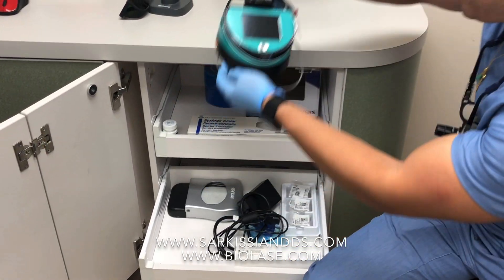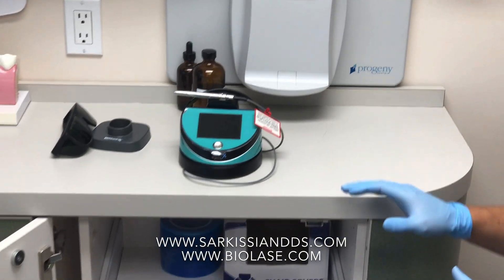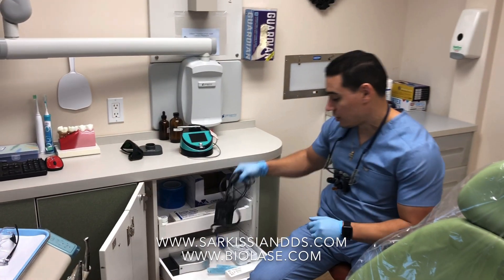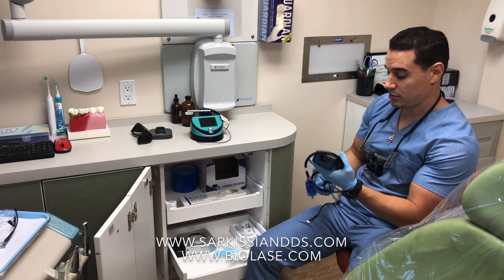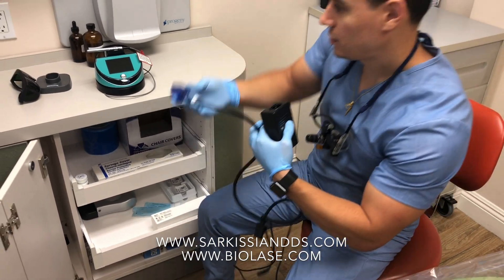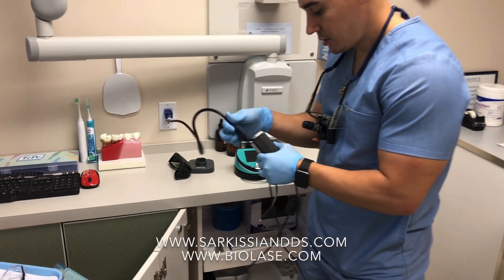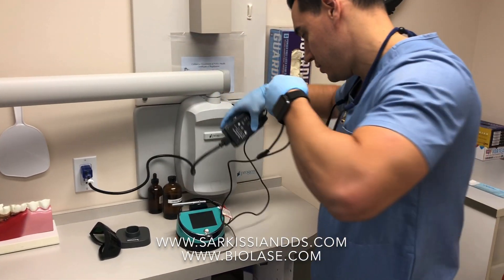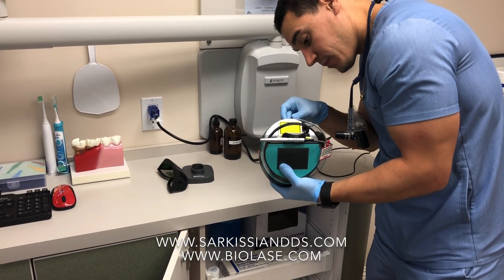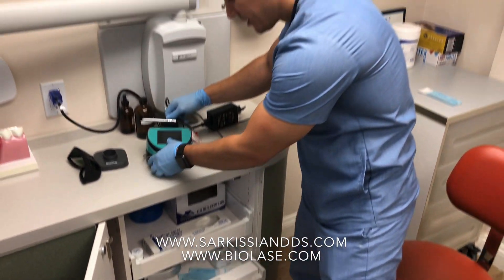First, you want to take the laser unit itself out and lay it on a flat surface where you can access it. If you're right-handed, you'll put it here; if you're left-handed, you'll put it on the cabinet across the room. You want to get the plug, put one end into the outlet — the power source — and then you'll find the insert on the back of the machine. So now your unit is plugged into the power.